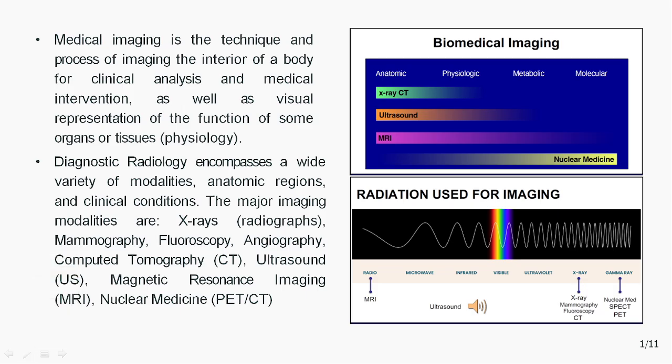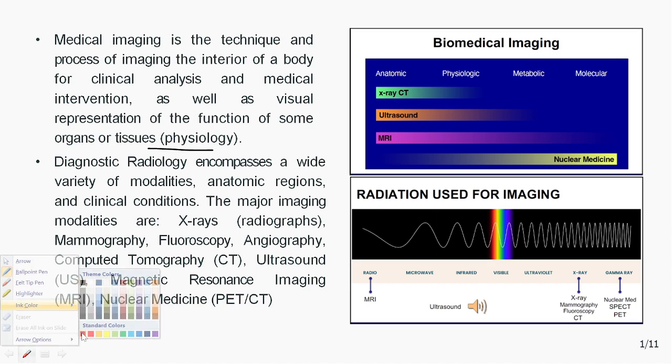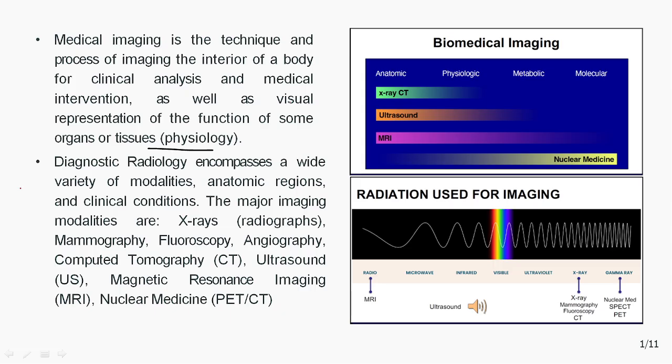analyze the physiological changes or activities without medical interventions. We can say that these are non-invasive methods. Okay, so these are non-invasive.